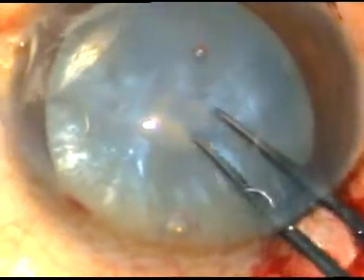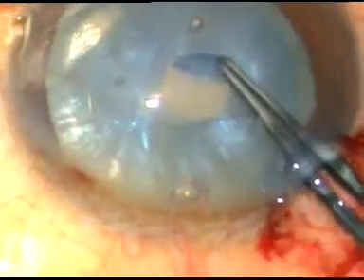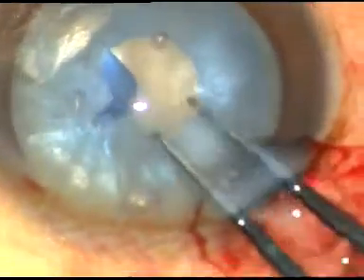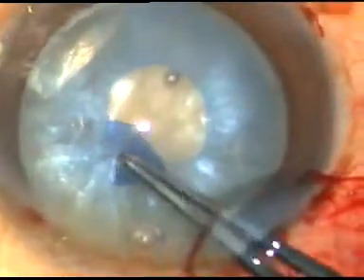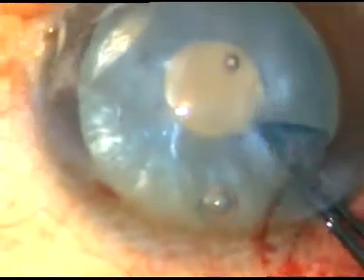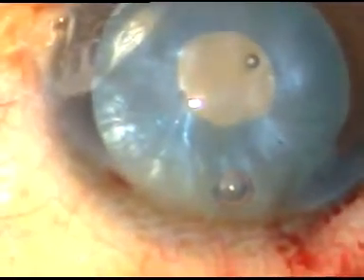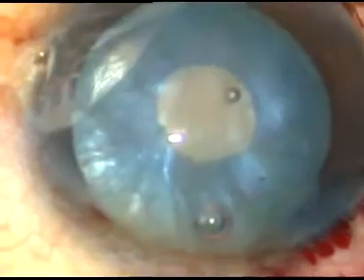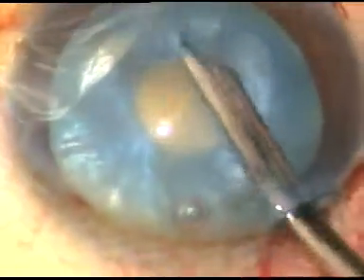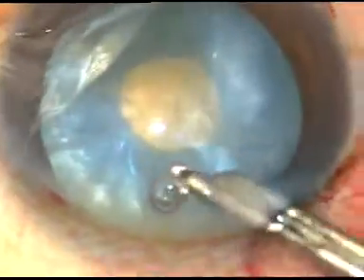Now hold this flap and do a very small rhexis. This is called a mini rhexis. Now, to decrease intra-lenticular pressure, the best way is to aspirate some lens matter from inside the bag.